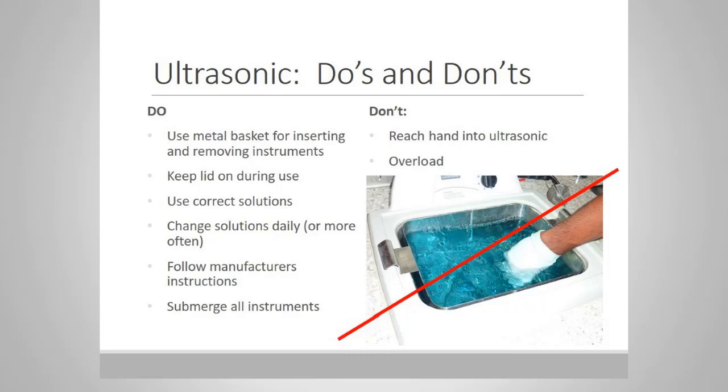At that point, it's probably not so effective. So if you see it's contaminated, you see debris floating in there, go ahead and change the solution more frequently. And this may be more appropriate in high volume practices or perhaps surgical settings where you have more debris on instruments. Do follow the manufacturer's instructions and do make sure that all instruments are indeed submerged.